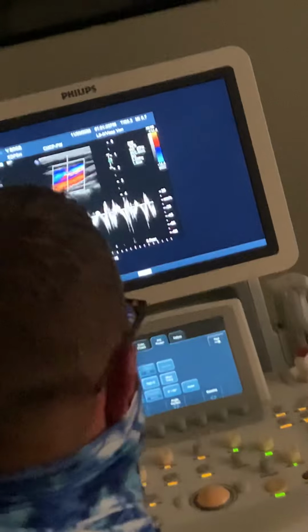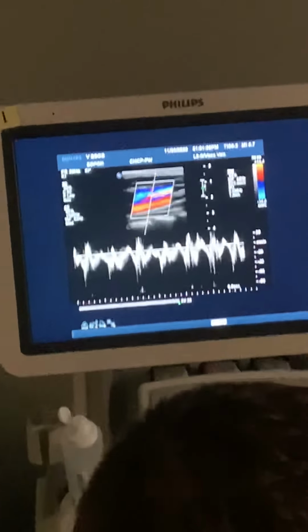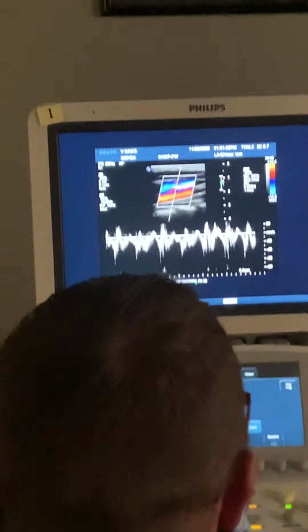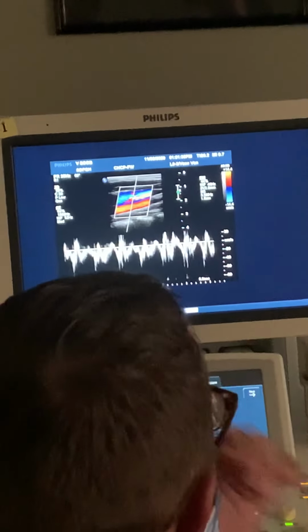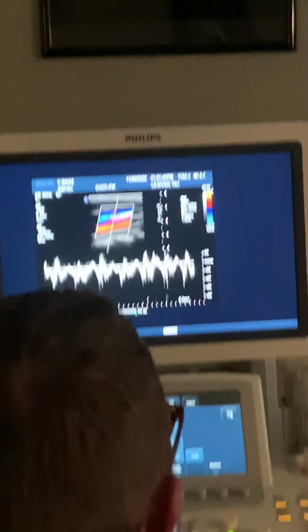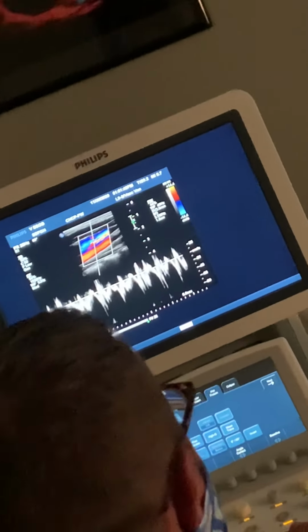And that's a normal jugular vein waveform. Messy, isn't it? It's very pulsatile. Why? The carotid's right here and it's banging into the side of it. So you're not going to get your normal phasicity. Why wouldn't you have a phasic waveform? What causes phasicity? Breathing. More specifically, you're right, breathing. But what about breathing?